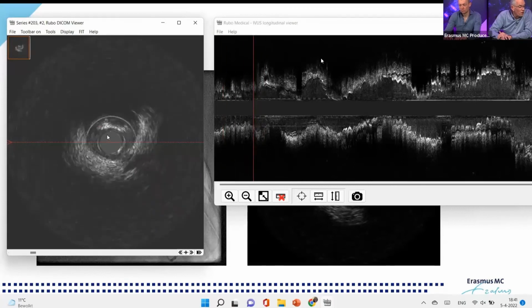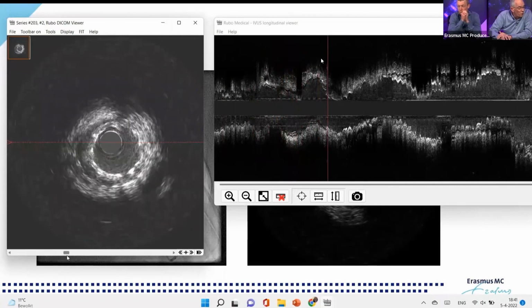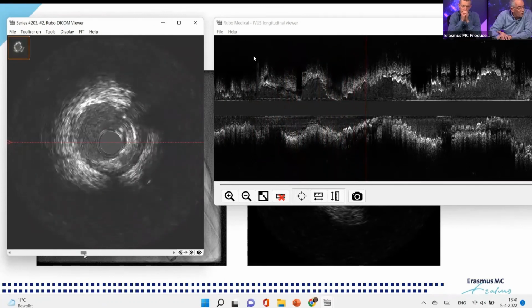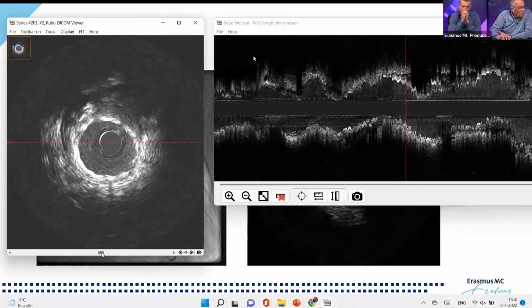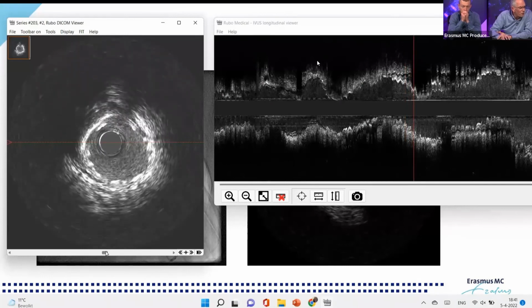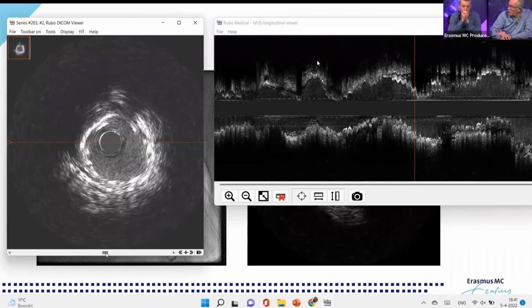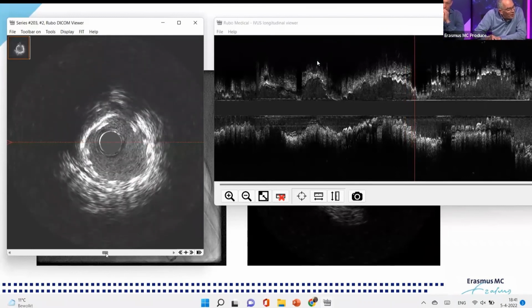So, of course, there is some more disease very distally, and the vessel is of course not a healthy vessel. And then here we have our stent. That's the distal stent, by the way. And often you have to find the overlap, especially with the 60 megahertz. Sometimes that is a bit challenging. I always calculate the length of the stent, how many frames that is, and then we can find the overlap. But for some reason, with the 60 megahertz, it's always a bit more difficult to see it in one spot. But I think that the overlap is proximally here.